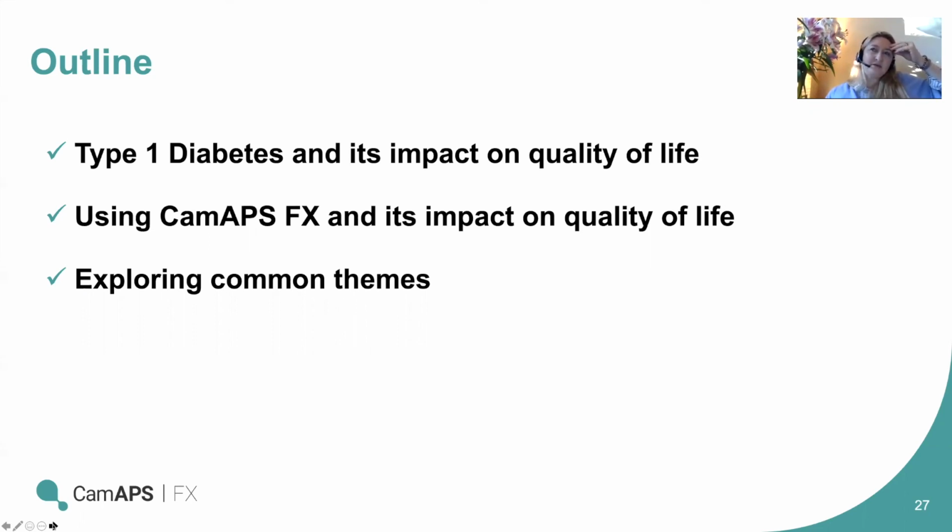I definitely would be talking with your diabetes team, because when you look at the way pumps are given funding, they are for either what's considered suboptimal control, i.e. an HbA1c of above 69 or 8.5%, or fear of disabling hypoglycemia. I think it's commonly felt that that's a bit of a catch-all. So I definitely would talk to your centre about supporting you to have pump therapy.